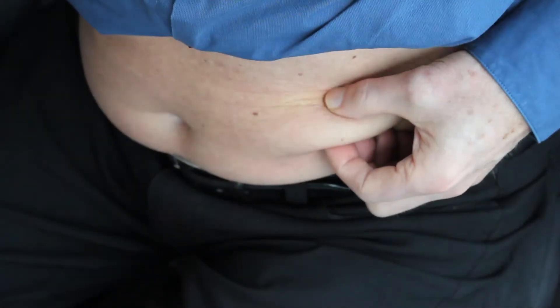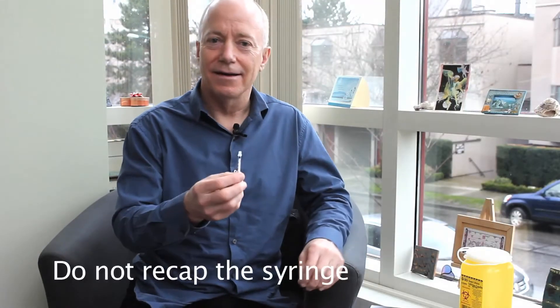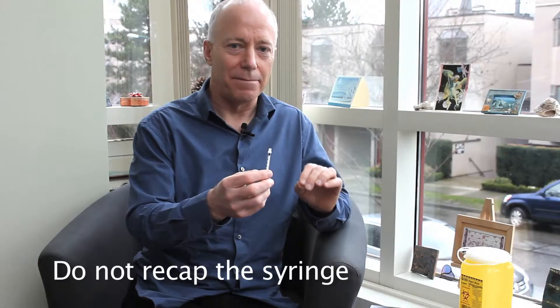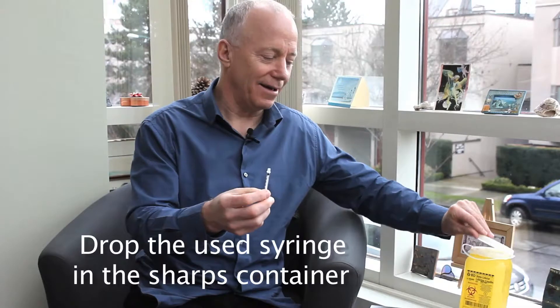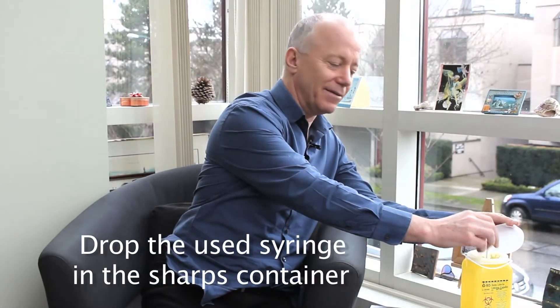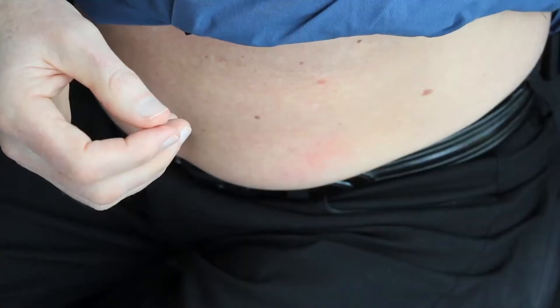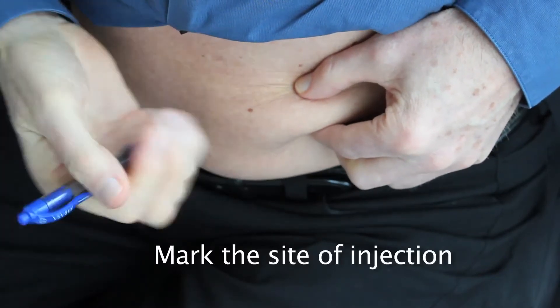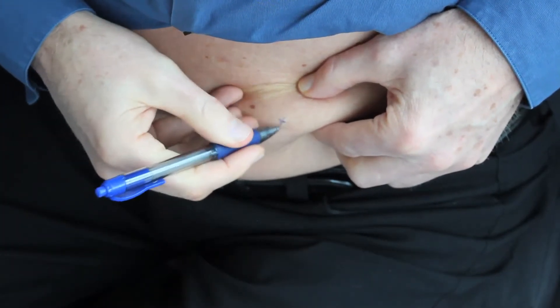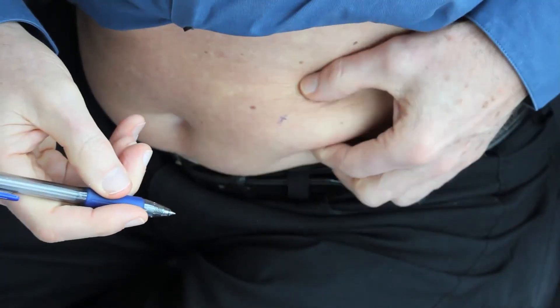Holding the syringe with one hand, press on the barrel with the other and inject the study treatment. Then draw the needle out quickly. Once the injection is complete, do not put the top back on the needle. Simply discard the used needle in the sharps container. Make sure you keep the sharps container out of the reach of children. Put a mark with a pen where you injected so that the following day you'll remember where the injection was given.